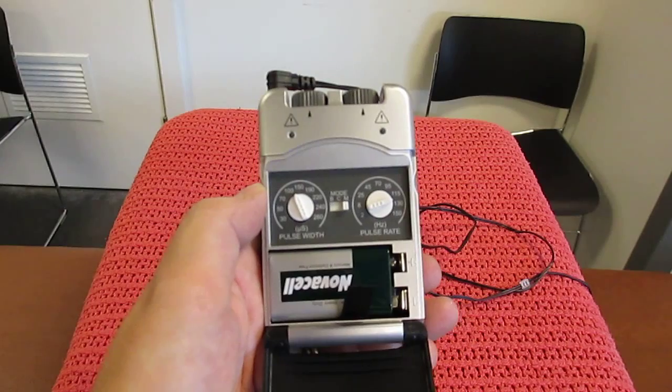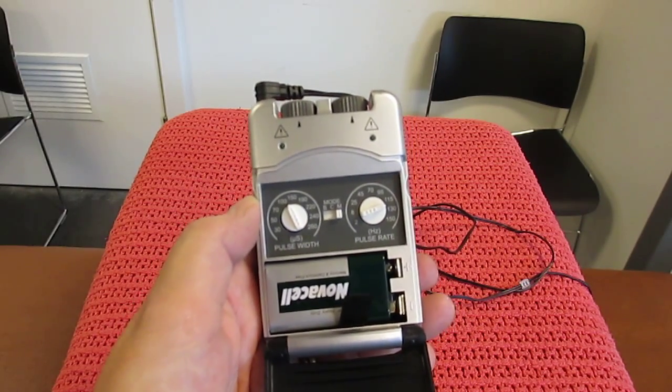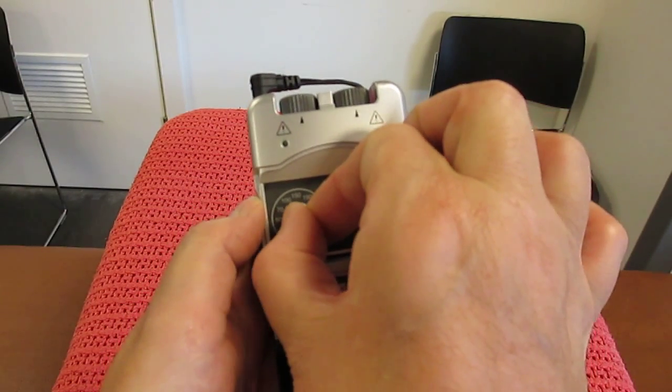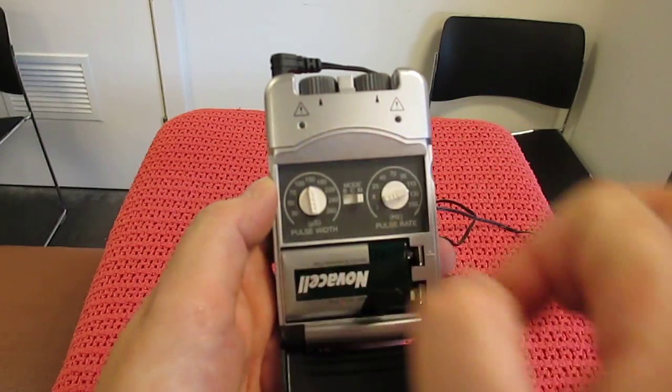You then select the pulse width duration. In this example we're going to select 150, which is at the top.